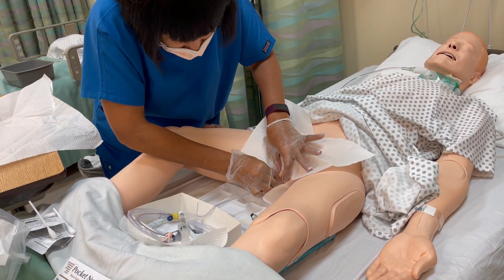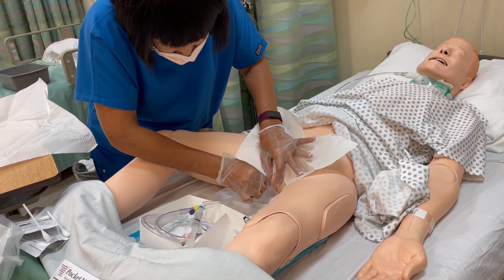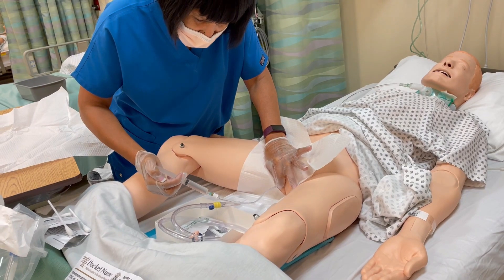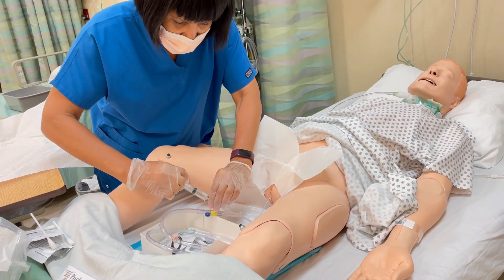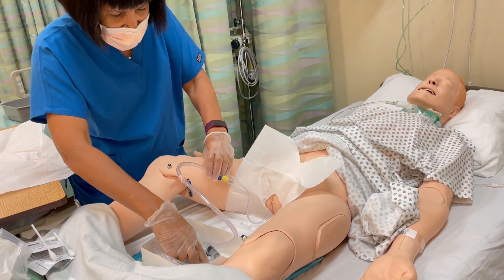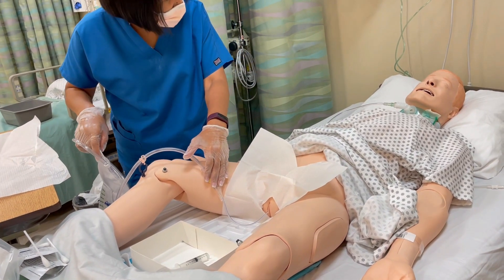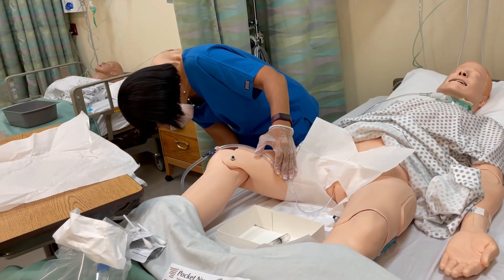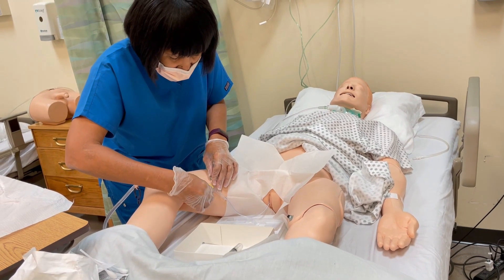Deep breath — good. There you go. Good job. Urine is coming back. I put it an inch and a half further up. There — hold it. I'm going to put my fluid in. Fluid going in. Good job. And then I take it off. Now pull it further down to make it sit at the neck of the bladder. Were you able to identify all 11 mistakes? It's important that we stay aware as we're using sterile technique. When we catch ourselves contaminating, we need to take proper steps to correct it, which usually means gathering new supplies and starting the procedure over. Patient safety is our priority — their lives are in our hands, so don't take any chances.